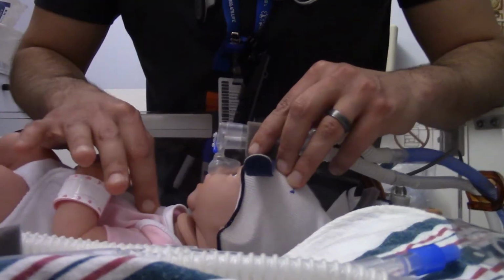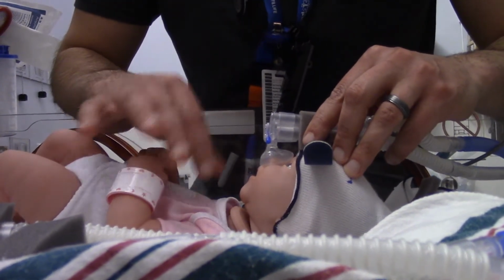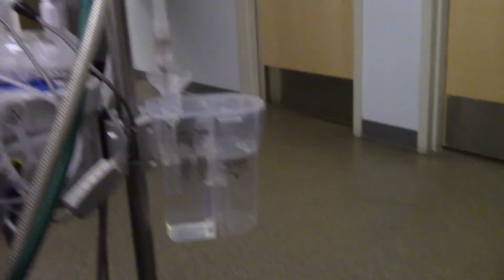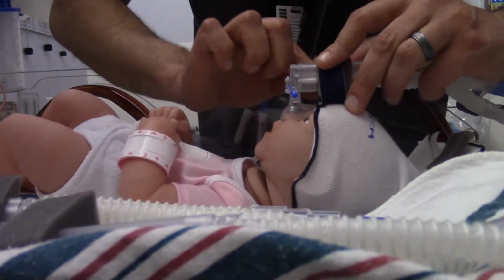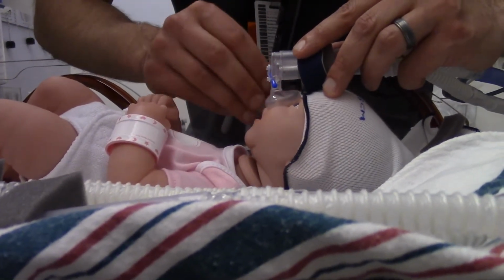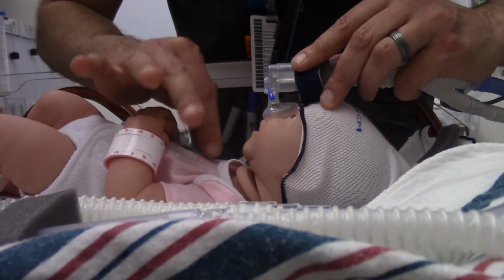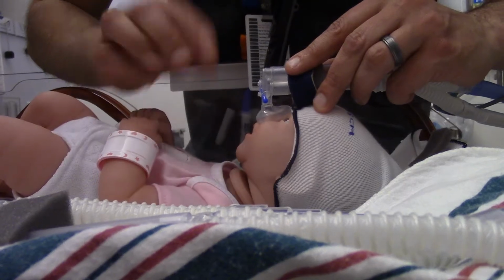Listening to the lungs is your best way of knowing that you are delivering the therapy. The same bubble that you hear back there, you should be hearing in the lungs once your interface is strapped in, correctly positioned, and baby is receiving therapy. Listening to the lungs, all fields of the lungs, you will hear a bubble if it's being done correctly.